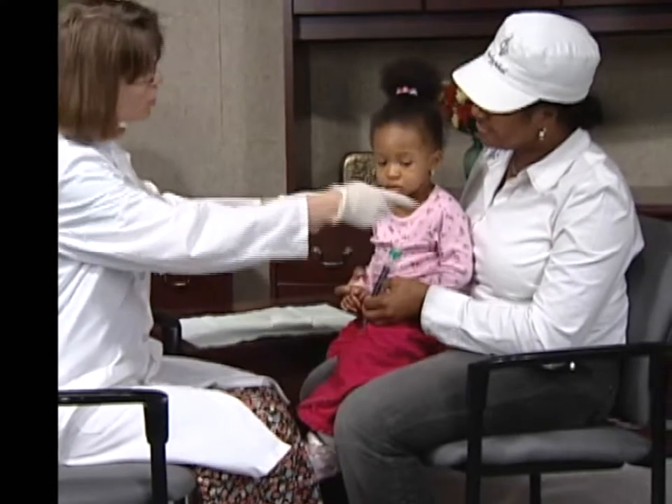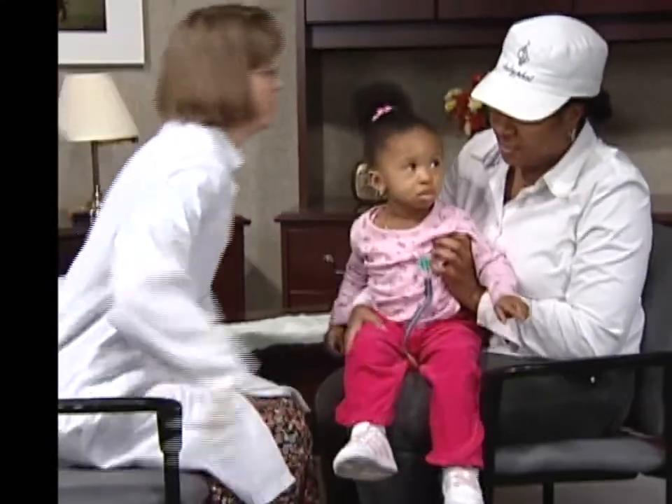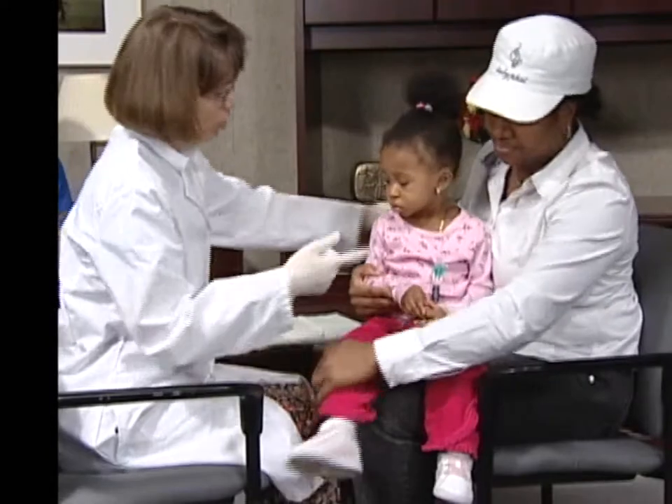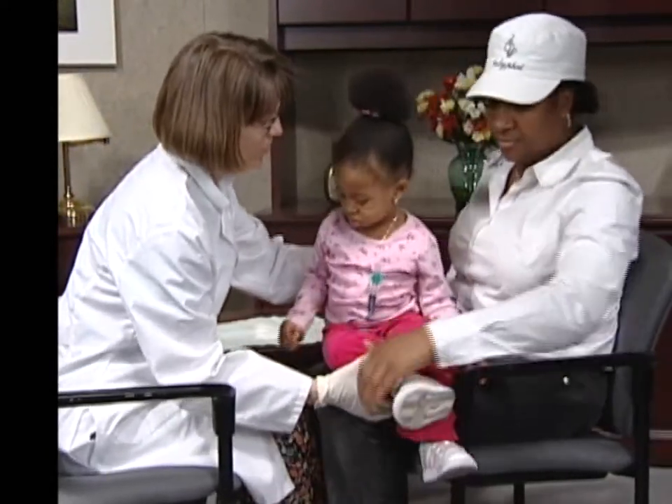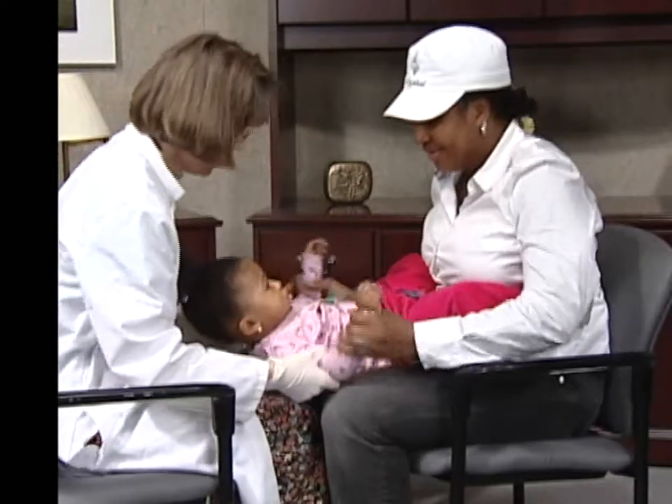When applying fluoride varnish, you want to get the child in a safe and comfortable position. Turn the child around so she is facing her mother, tip her back onto your lap, and place her legs around mom's hips. Mom should hold her hands.